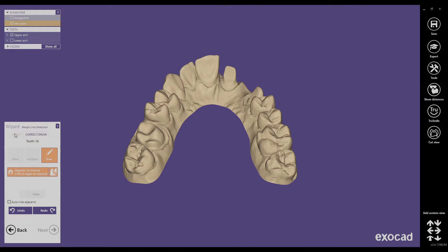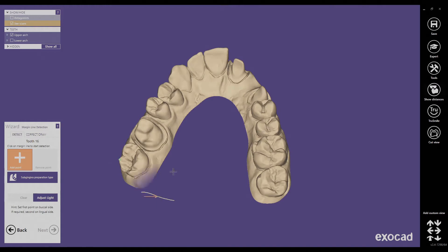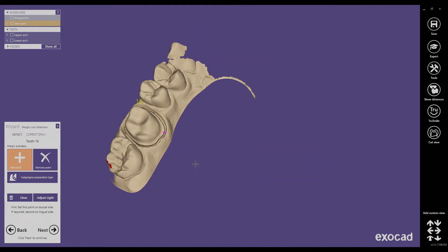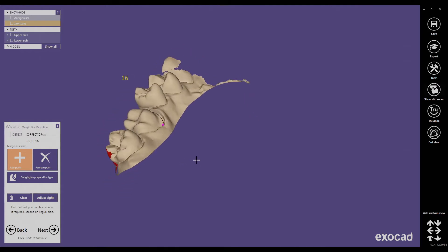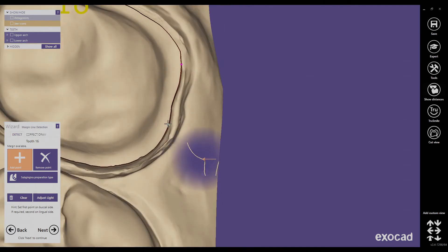Since we haven't designed any restoration yet, we have to tell Exocut where the margin line is. The margin line defined here will be used in the design process. You can still modify the margin line during design, but keep in mind that if you do, the margin line of your restorations and the margin line of the model dies will not match. I am using automatic detection — I just click on the margin and Exocut tries to find it. With a good scan this works well, but with a lower quality scan you will have more problems.